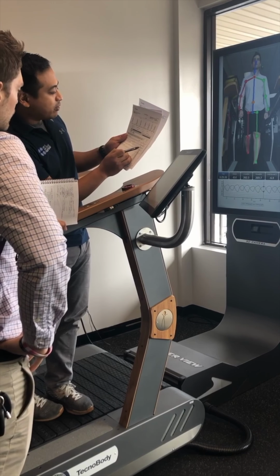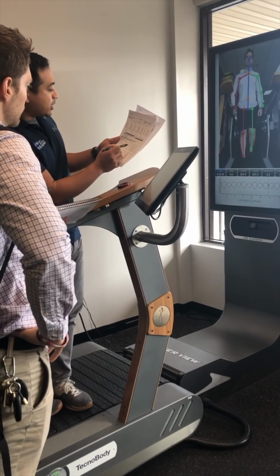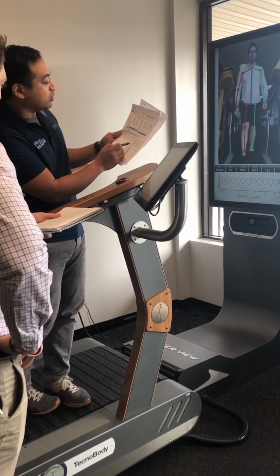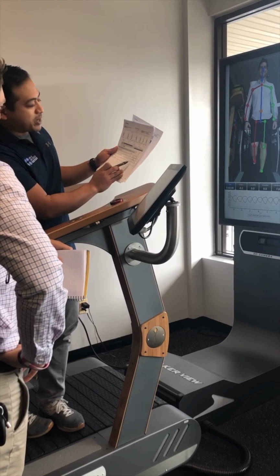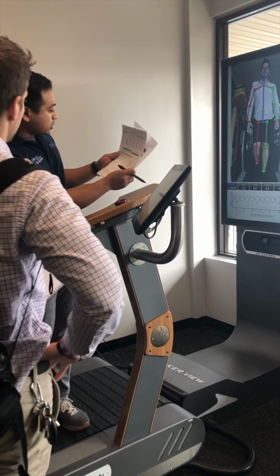Again, we talked about that high variance of your steps, right? We want that to be standardized. Sometimes you'll take a 24-inch step, sometimes you'll take a 22, sometimes a 26, and then contact time. So these should be basically the same. If it's not the same, that means there's something there.